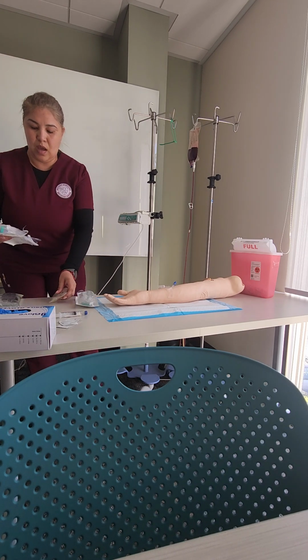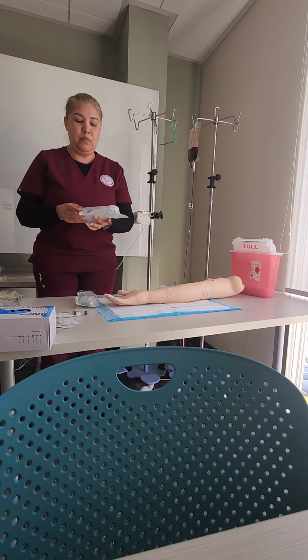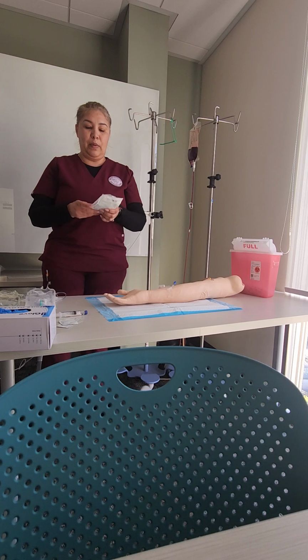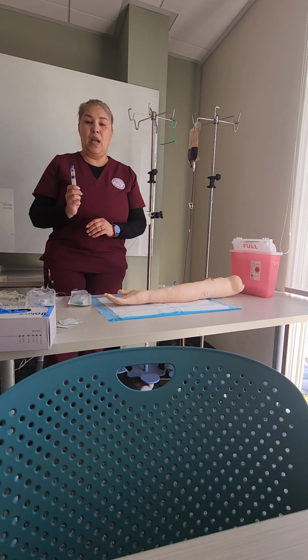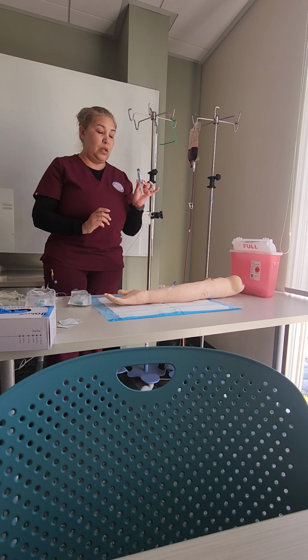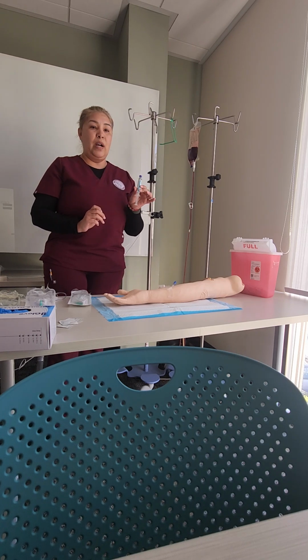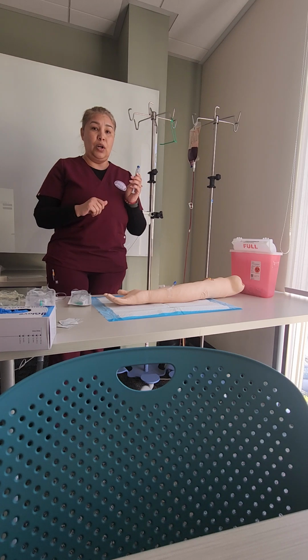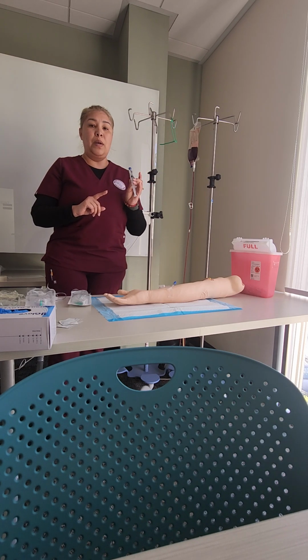I want to have my tubing for my primary, my tubing for my secondary, and a saline flush. Before inserting the tubing, I want to flush out the IV that they currently have on already, that I placed earlier today, because I want to make sure that the IV is still good.